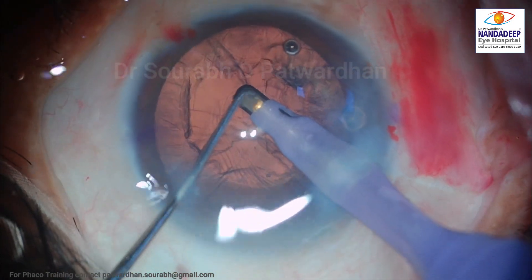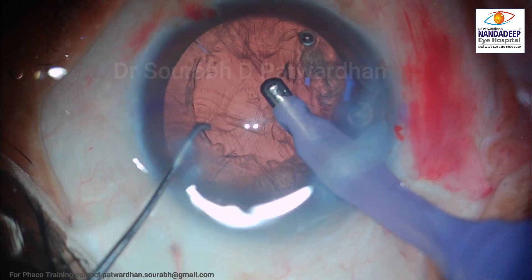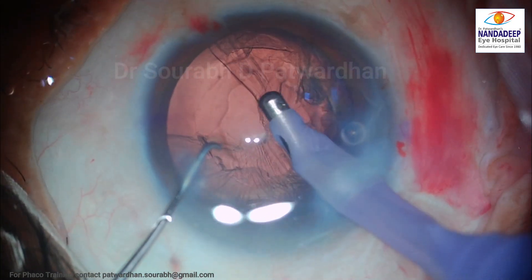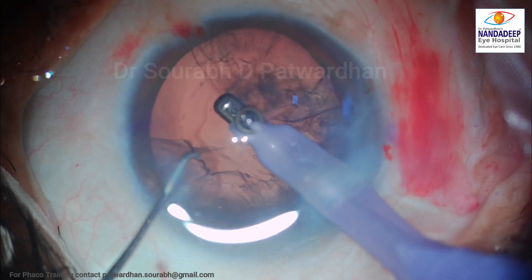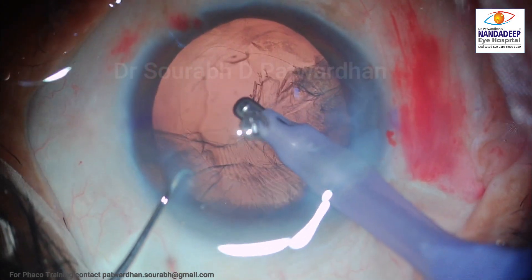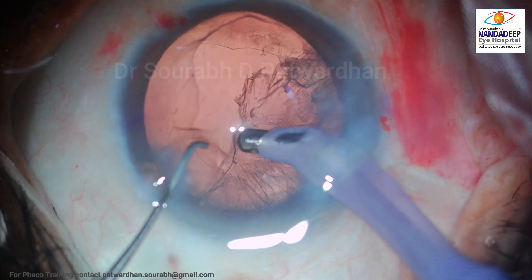As I start off the cortex aspiration, I could see there was a small nucleus piece which had to be removed first, and then I start off with the cortex aspiration. I can feel that the posterior capsule is a little bit redundant here, possibly because the fluid has gone behind it in the Berger space. And you can see the small opacities behind the posterior capsule indicating the accumulation of fluid there.